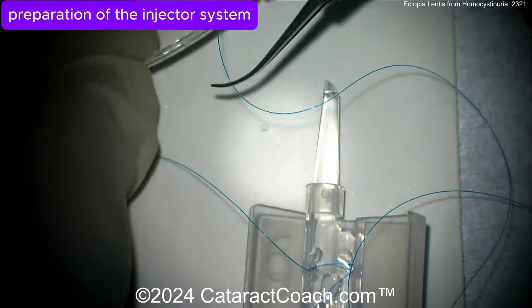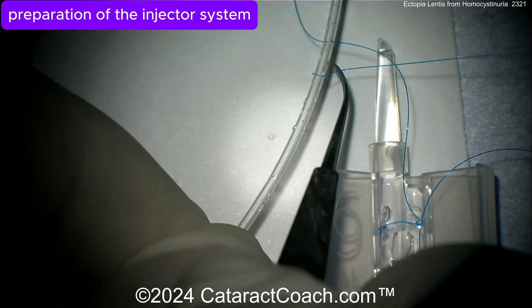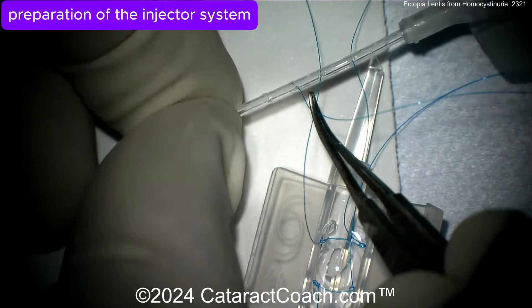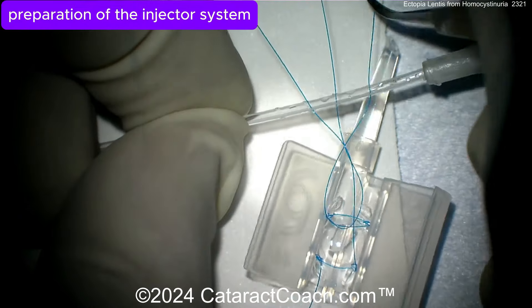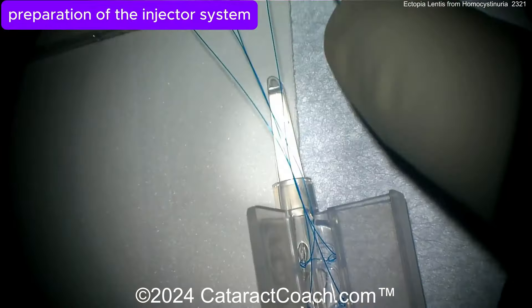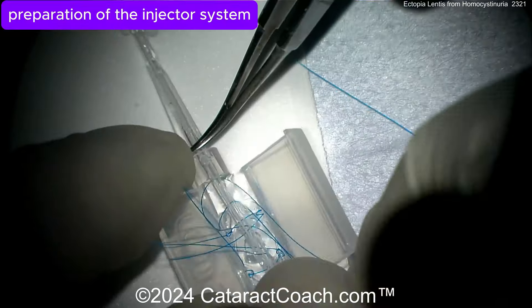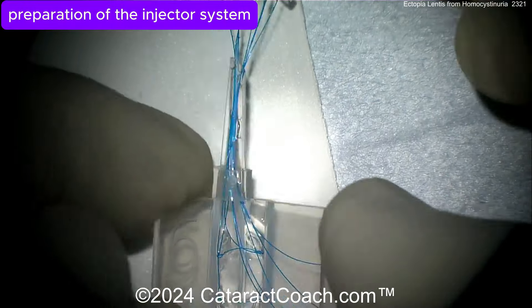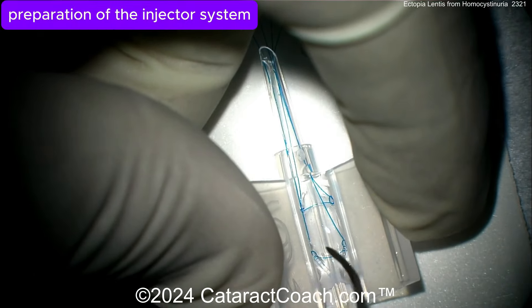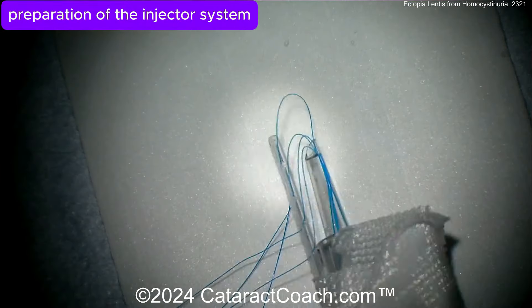Once those suture loops are placed, all four haptics are now sutured up and the lens can be loaded into the injector. The long suture ends are threaded through first. The key here is keeping all the suture material — all the spaghetti — straight. Once they are straight, you can advance the lens into the eye, thread the sutures appropriately, insert the lens, and pull it all through.